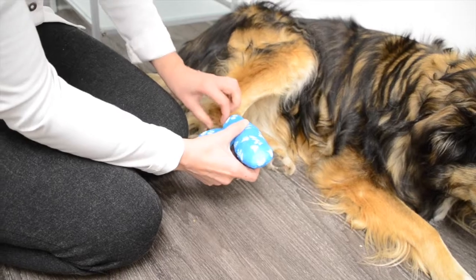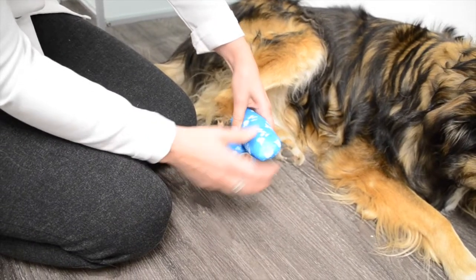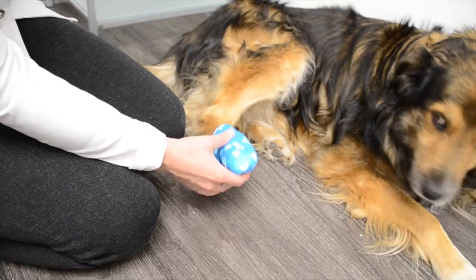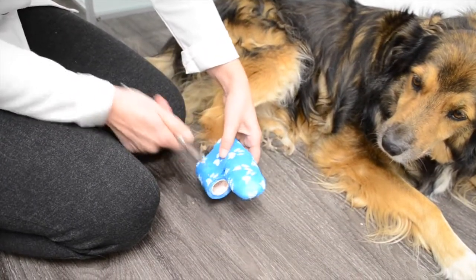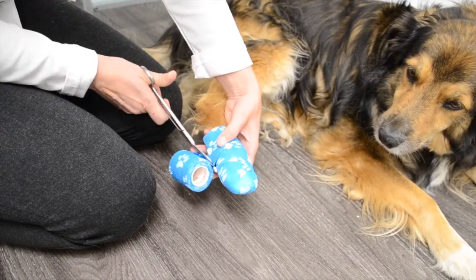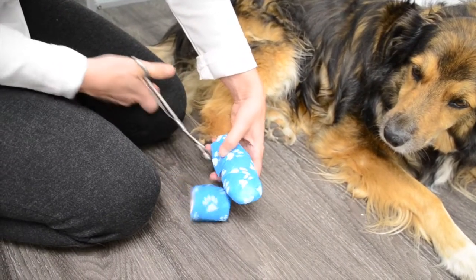So in this case, again, we're not going to go very high. So there's her little tiny paw bandage. I'm going to cut that off. Some of this stuff is tearable, but when you tear it, you really do put a lot of pressure on that. So I'm just going to go ahead and cut it because I've got some scissors here. There we go.